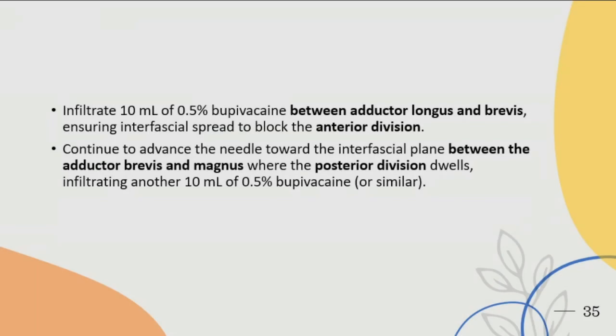Actually, last time when I was doing my regional posting, unfortunately there wasn't a pain specialist. There was this one time, I'm talking about peripheral nerve block per se, I was so scared that time. I will use the dual method, nerve stimulator plus ultrasound. I think femoral is quite easy to see. I don't think it's a necessity to use a nerve stimulator, as long as you get under the fascial plane.